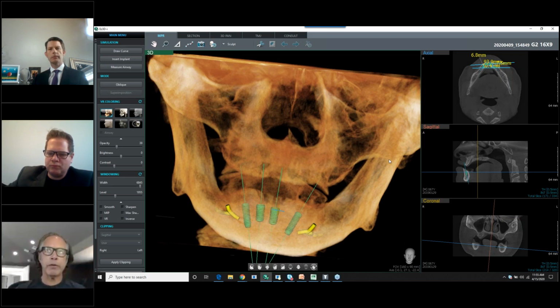And I think there are very few tools in dentistry that allow you to share the cord, if you will. How can we do that with composites? How can we do that with endo? We can, don't get me wrong, but to the level of a big treatment plan as it relates to communicating the value of a treatment plan, this is a cornerstone piece. So the first thing I want to say is, we now have a commonality where we both can jump off a platform. The second thing is we can show them the pros and cons about the treatment that they're interested in.